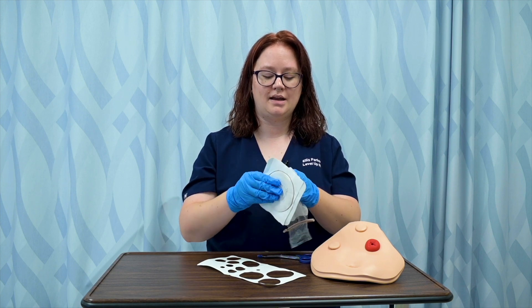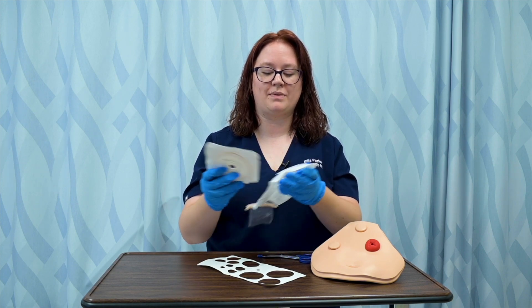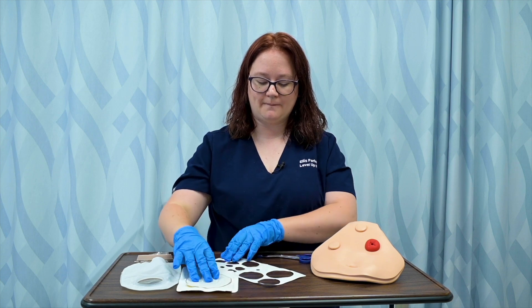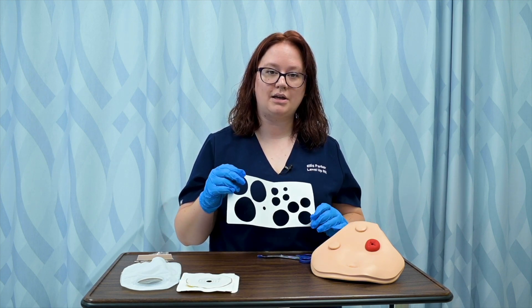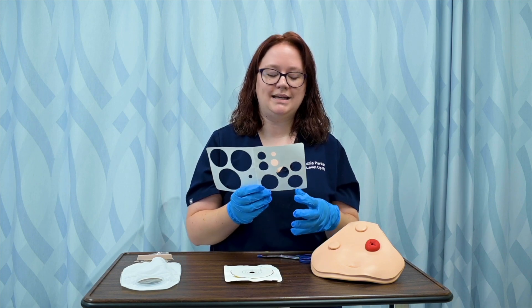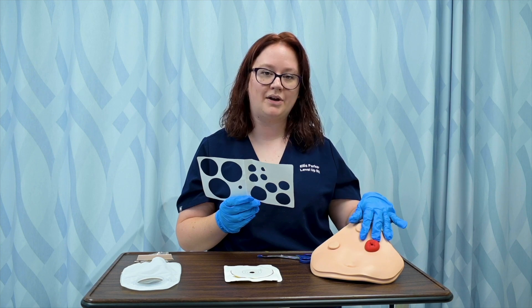The system I'm using is a two-piece today, so I'm going to go ahead and separate it so I can work with my wafer because I'll be needing to cut the ostomy size. I take my measuring tool and I'm going to place it over the ostomy itself so that I know what size to cut my wafer.